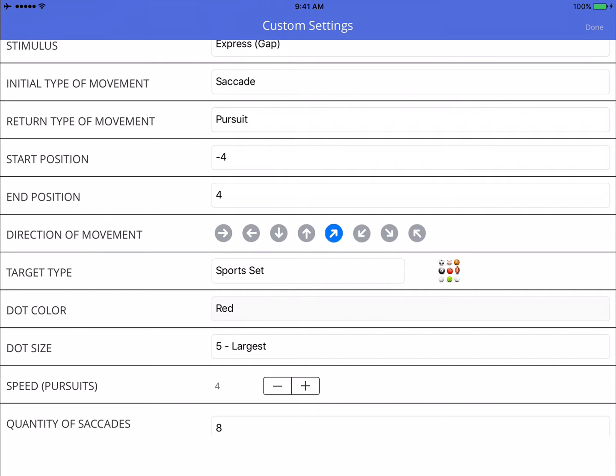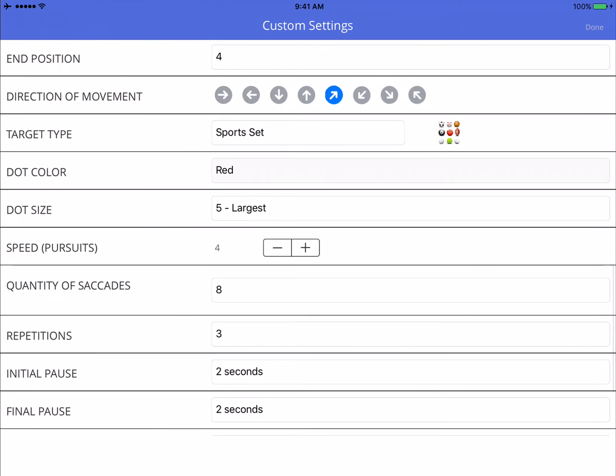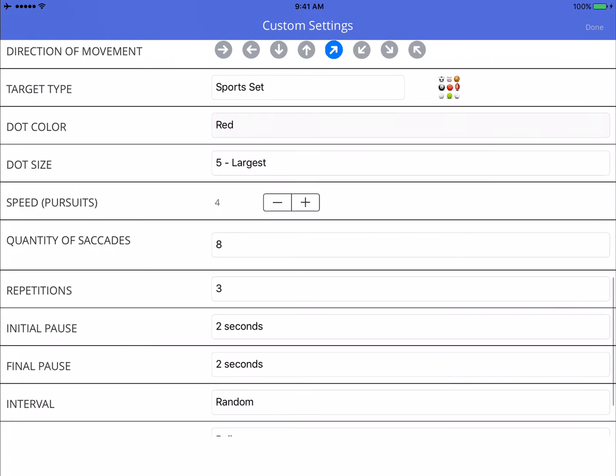We're going to do bilateral stimulation. The great thing about the diagonal eye movements is that they are very powerful or most effective for a hemisphere stimulation, including the cerebellum and the midbrain. And so in this case here, I'm using large targets. This is an older fellow, and I want to make sure he can see the target very well. The pursuit speed is going to be at 4.